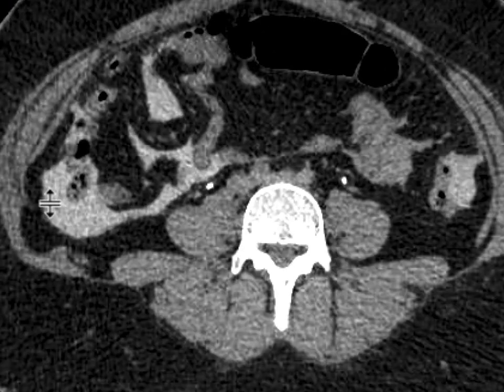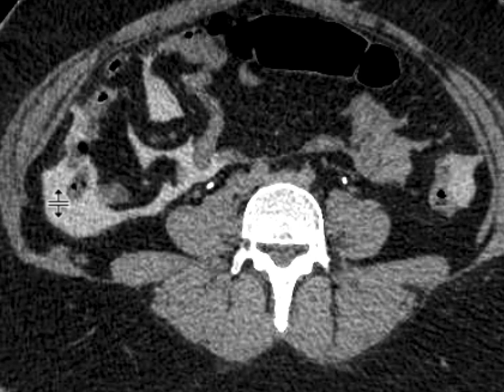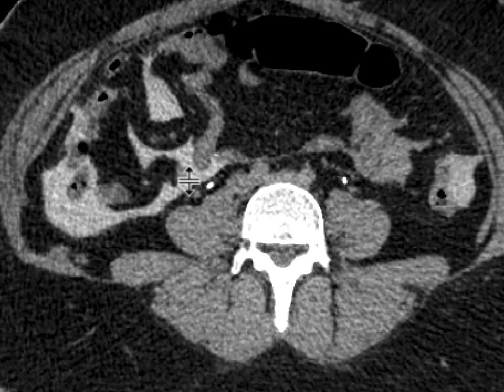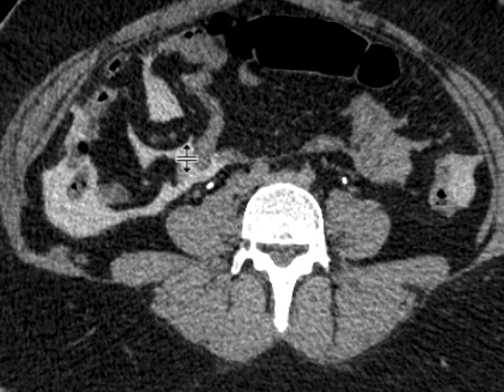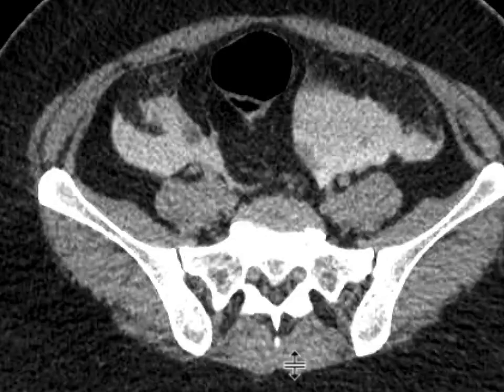Once we give contrast to the Foley catheter, we can immediately see that there's contrast through layering the pericolic gutter bilaterally, interweaving between the different mesenteric leaves over here.